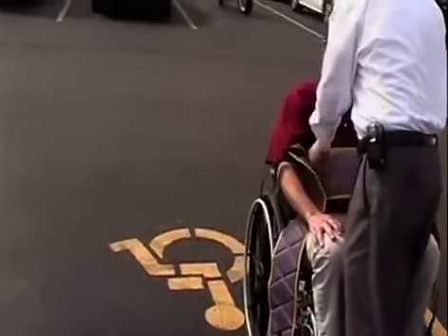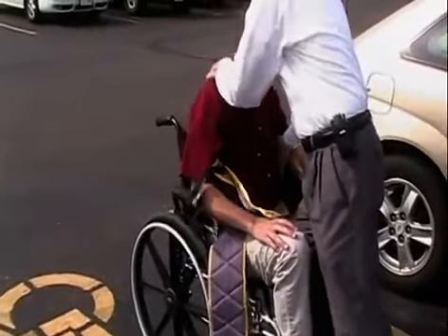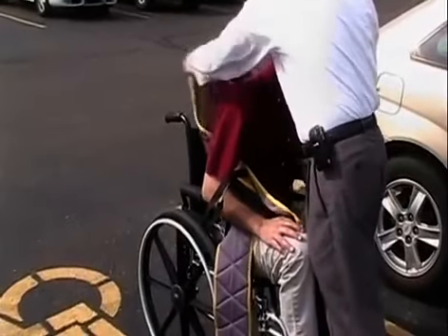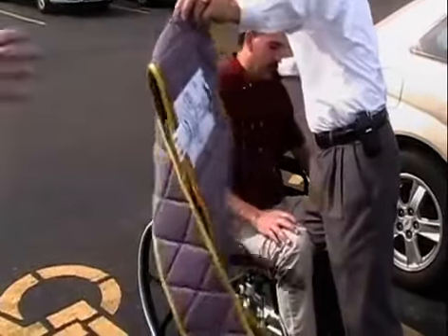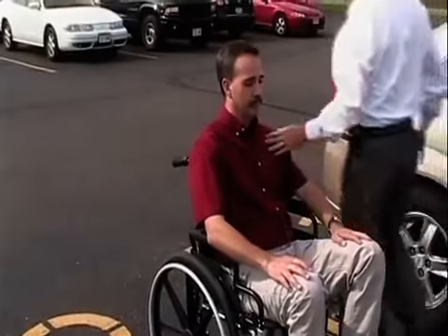Now, the last thing I'm going to do is I'm going to lean you forward and I'm going to draw this out from one side to the other. Are you comfortable there? All right.